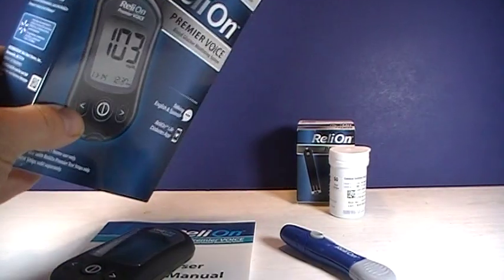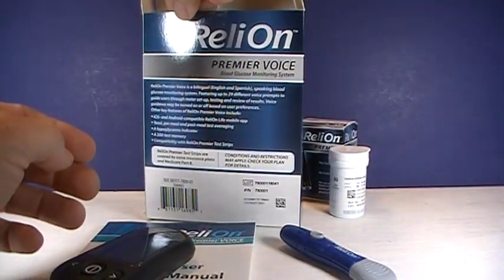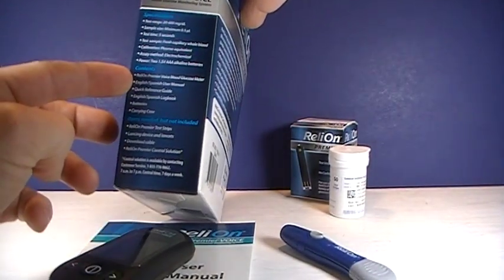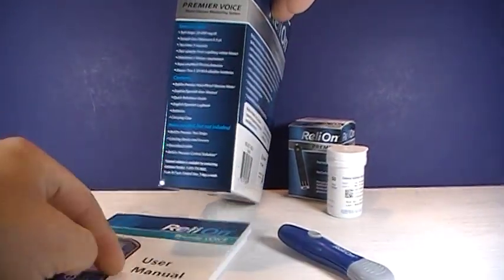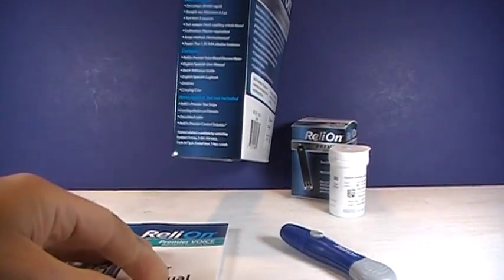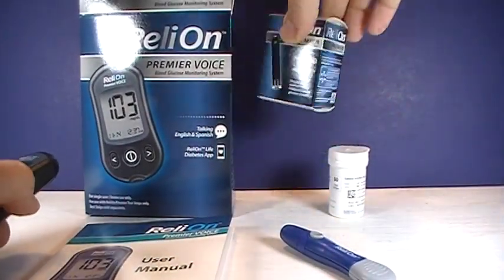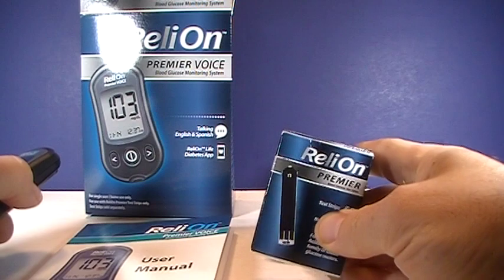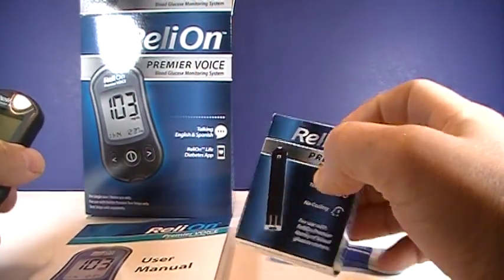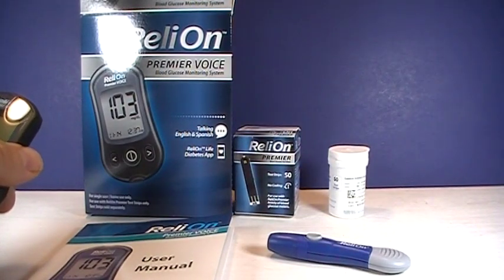It sells for about $15 in Walmart stores, and I believe you can get it online as well. It comes with the meter, the user guide in both English and Spanish, a logbook, batteries, and a carrying case. You will need to purchase the test strips separately. They're about $18 for 100 strips, so $0.18 a strip — very affordable as far as glucose testing strips go.